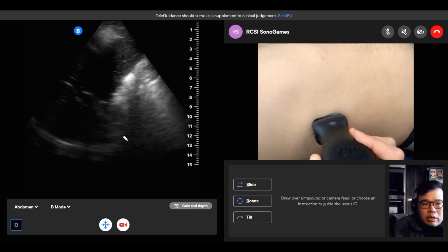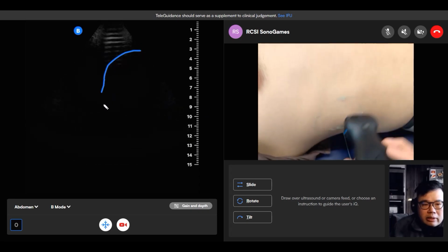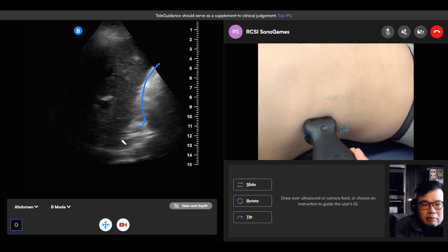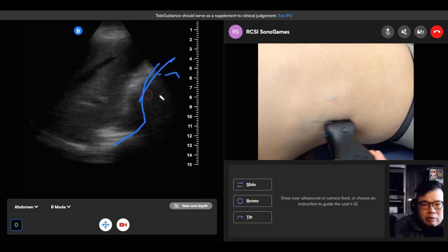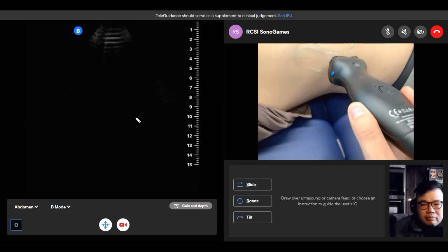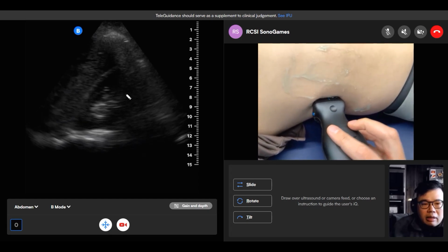Now, are you in the right space actually? Because what's all this stuff here? Oh, sorry. You see all this here? Yeah. Why is it all so fluffy? Usually you'd expect the kidney, wouldn't you? Yeah, there you go.